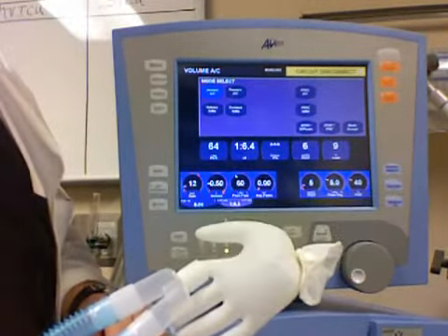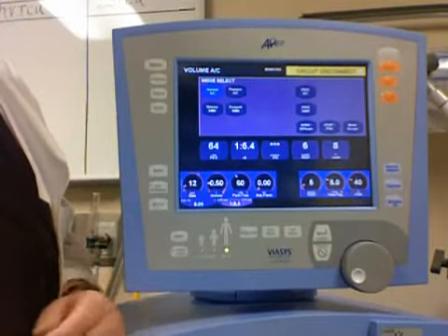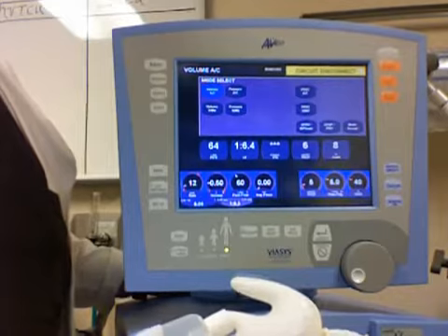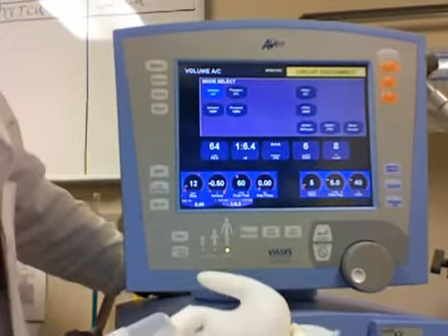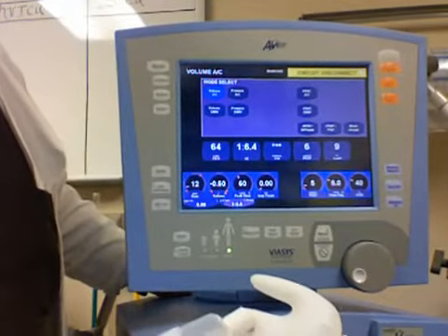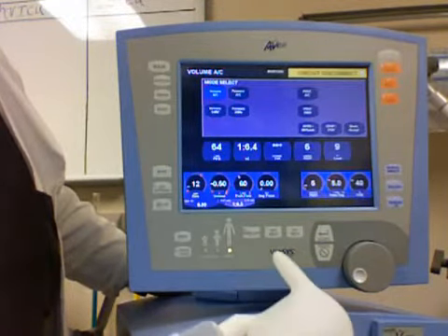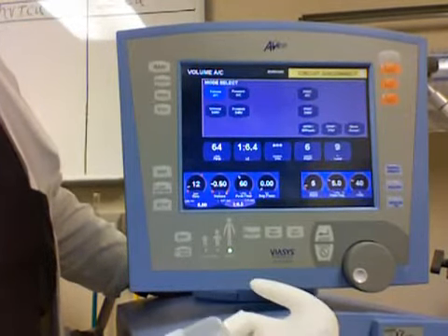In our hospital, volume ventilation or volume cycled ventilation, cycling is what ends the breath, is the most common. In other words, they choose a tidal volume for the patient, and that is the criteria that ends the breath. Typically they might go by 10 milliliters per kilo of body weight. So if you get a 70 kilogram man, whose ideal body weight is 70 kilos, then you might pick 700 cc tidal volume. So that's typically the ending criteria.